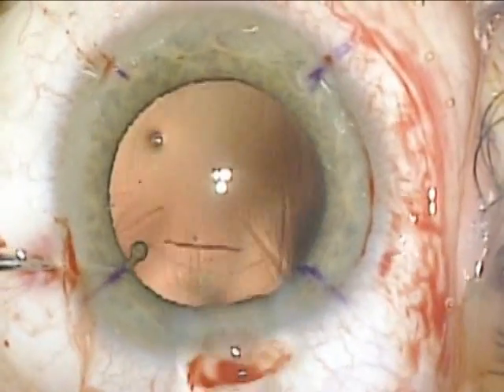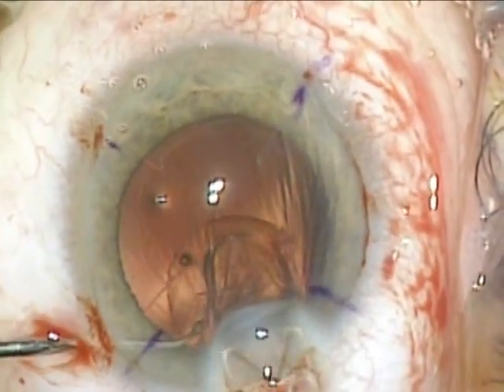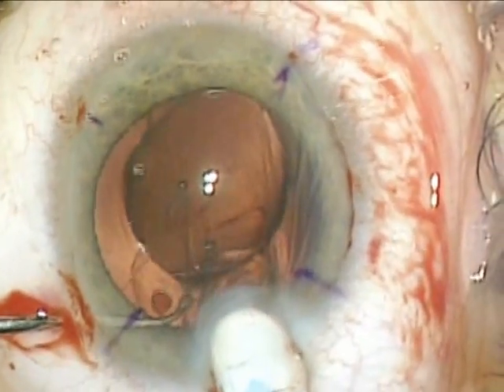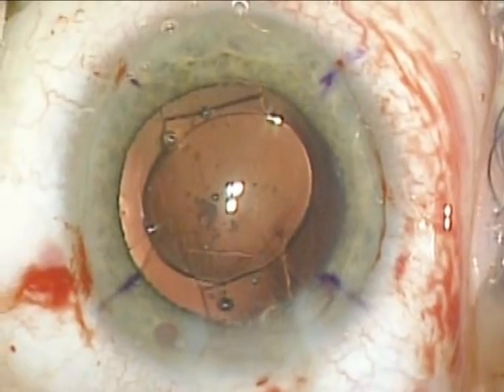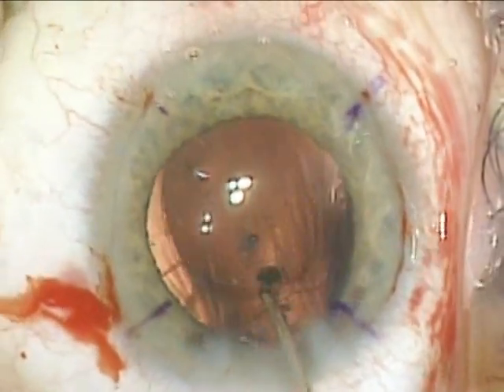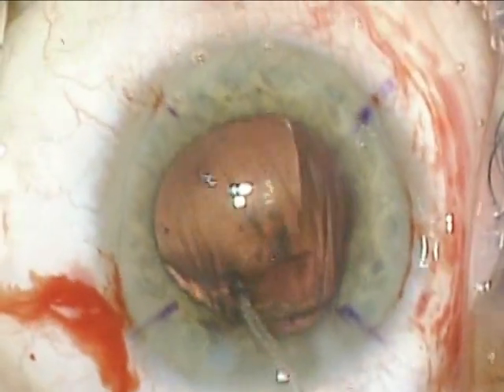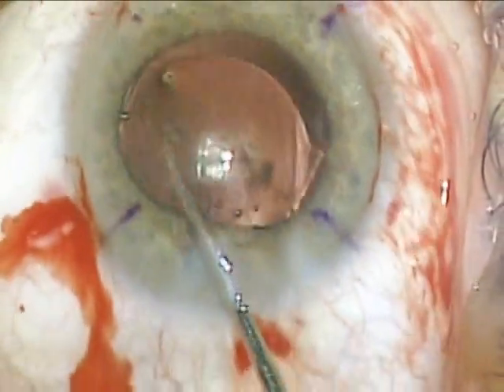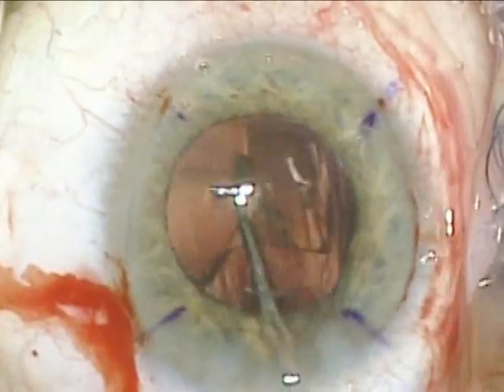I insert the injector through the 2.8 millimeter incision. It's a little bit of a tight fit but I go slow and inject the lens until the body of the lens is out, then use the tip portion of the injector to inject the entire lens into the anterior chamber. I then take a second instrument such as a Kuglen hook and by pushing the lens inferiorly away from the surgeon I can pop both haptics into the capsular bag. I always rotate into the 12 to 6 o'clock position.